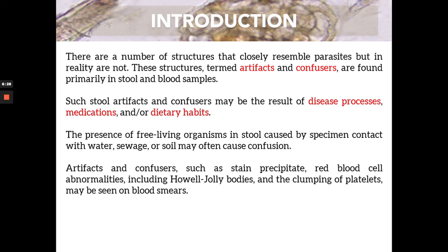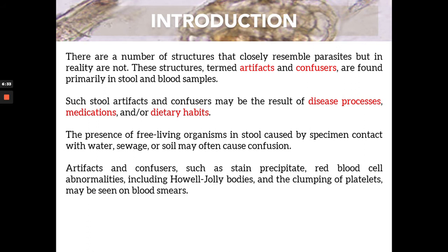For blood samples, artifacts and confusers could be stain precipitate — precipitates from the stain itself during the staining process. They are not significant. There could also be RBC abnormalities, which are important in hematology but not significant in parasitology.